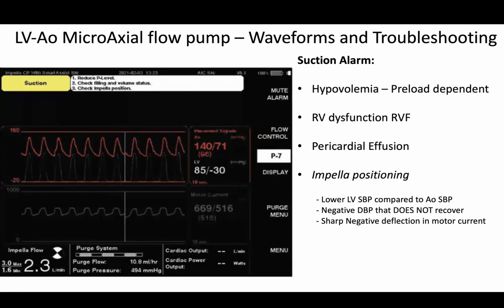You don't want to lock it, but you can pull that down and that will often decrease bleeding. We did that over the weekend with an Impella that had been put in. We pulled it up to cinch it down a little bit there to decrease the bleeding. If anybody doesn't understand what I'm saying, I'm happy to show. It's just a way of decreasing the bleeding that can occur around the groin and around the sheath. Yeah, we'll talk a little bit about that as well.